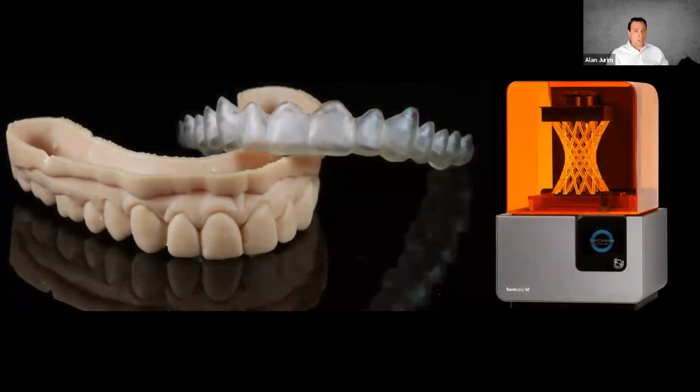So this was also one of the first cases where we printed our first digital night guard, a digital bite splint. And I was Pankey trained when it comes to producing bite splints. I was making them by hand for years before we began producing them digitally.